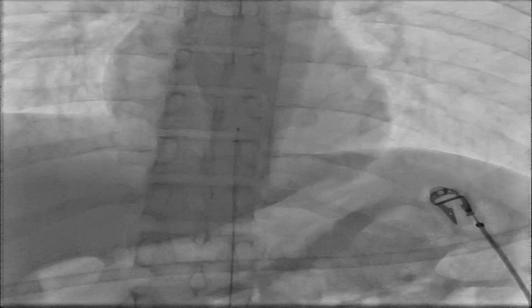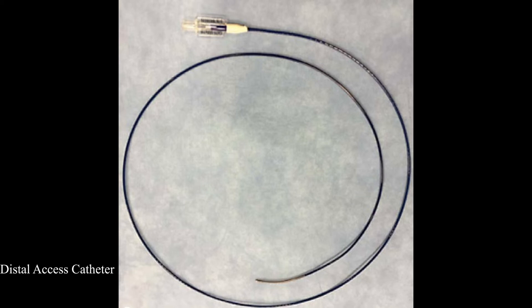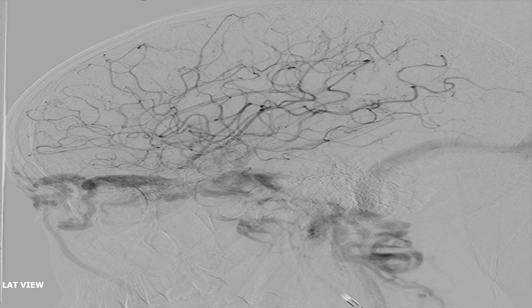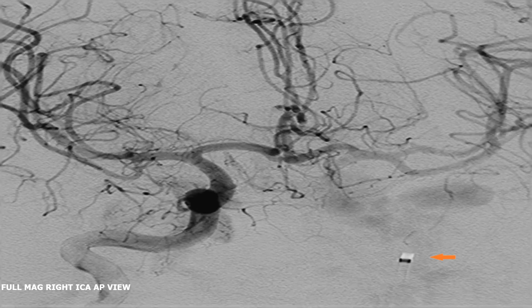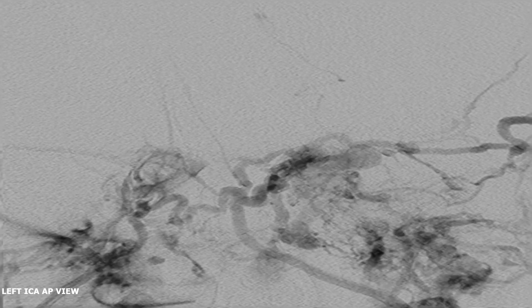A distal access intermediate catheter was taken up from the right femoral artery and placed in the left ICA at the fistula site, followed by an Echelon micro catheter with synchro micro guide wire and a super-compliant Transform balloon. Biplanar fluoroscopy from the right ICA showed cross-flow to the other side, followed by road map formation. Full magnification fluoroscopy from both the right and left ICA was taken, with visualization of the distal access catheter in the left ICA, the fistula site, and the dilated tortuous ophthalmic vein.